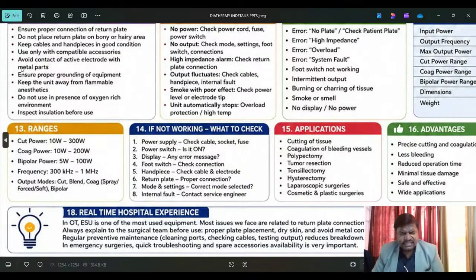As biomedical engineers, listen carefully. You should give training about all medical equipment on a weekly or monthly basis. You have to coordinate with all hospital staff. Then there are many chances to reduce complaints and increase everybody's awareness about medical equipment. In a hospital, everybody should be aware of the medical equipment. Not everybody operates it, but everybody should know the importance of medical equipment. That is the responsibility of the biomedical engineers in hospitals.